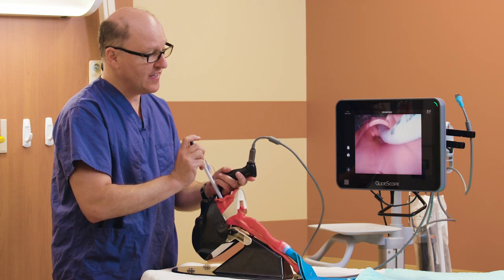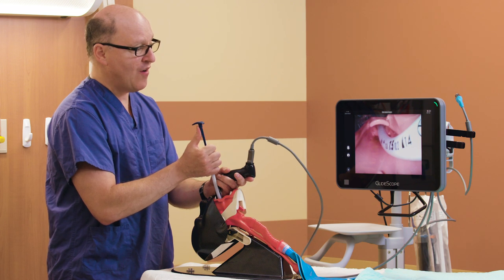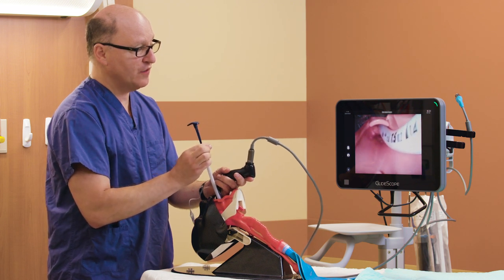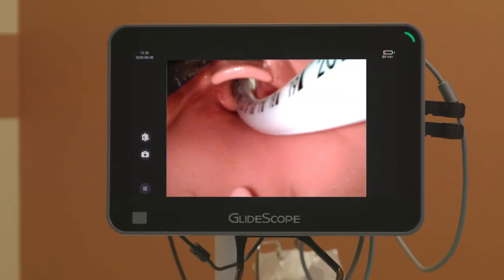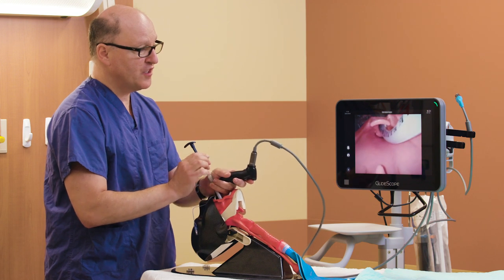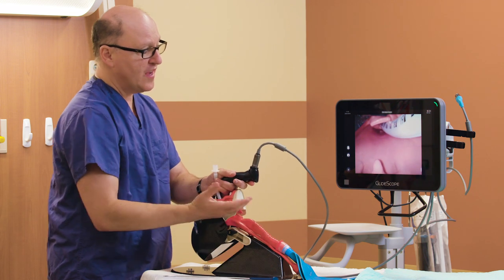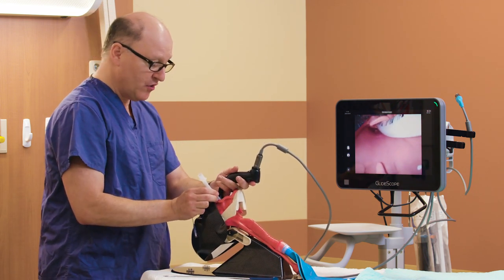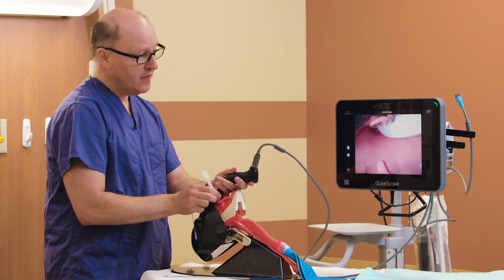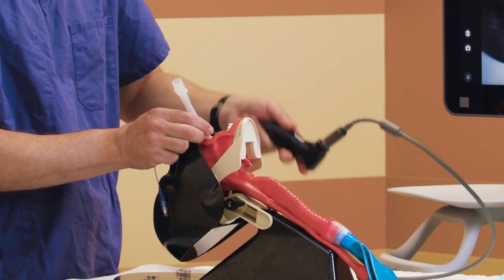Once I enter the larynx, I stop, I pop the stylet up, and now I can further advance the tracheal tube. Notice it's important to check the depth of insertion, and then on removal of the stylet, you want to make sure that the stylet is coming out towards the feet. That way, you do not have upward traction on the tracheal tube. I secure the tracheal tube at its proper depth, holding it close to the dentition, and then back out the blade.